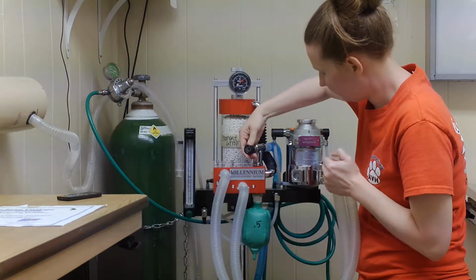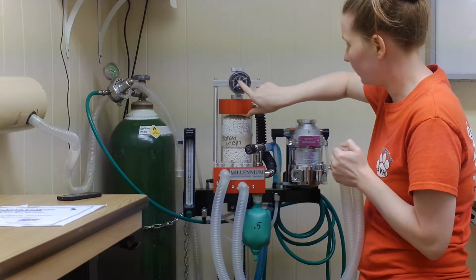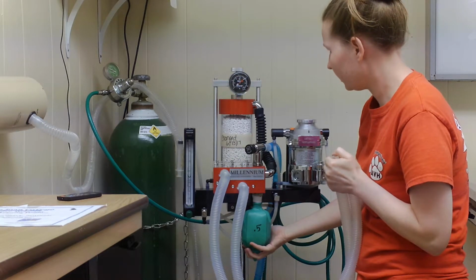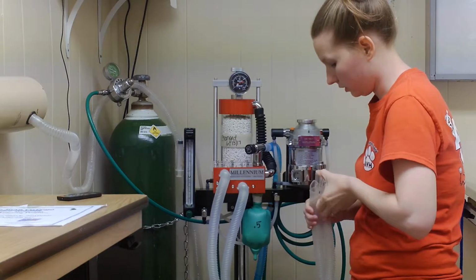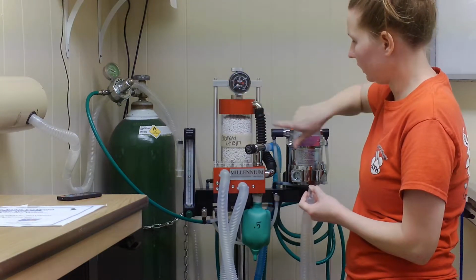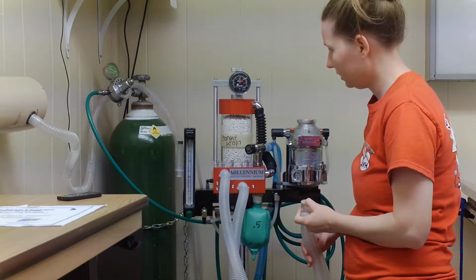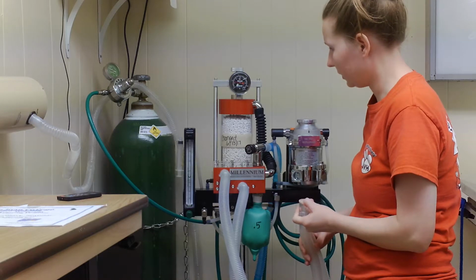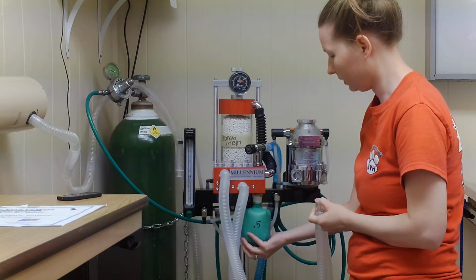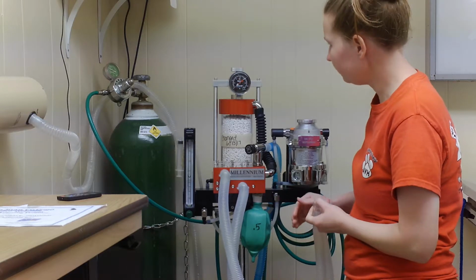And I can close the pop-off valve, and you can see the gauge starting to come up. You usually don't want it to go past 22 to 25 centimeters of water. And you can see that, oh, I don't have my finger on there properly, so it's got a little bit of a leak. I don't have a big finger. You see it rising, and I don't hear any leaks. And you just test that a couple of times and really listen closely. But you see that the breather bag is filling up nicely, and it's not leaking. I don't hear any leaks anywhere on the machine. And it's doing pretty good.